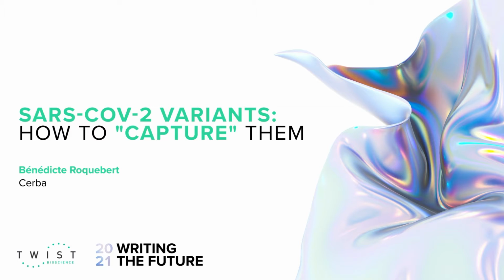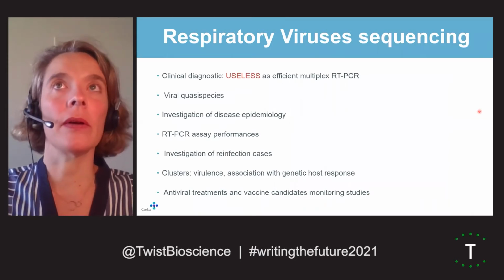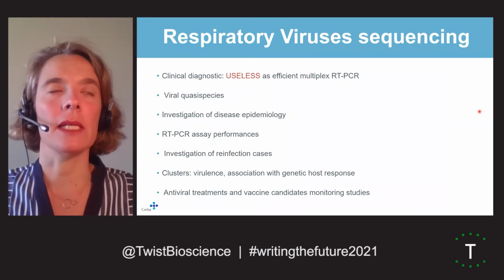To get started, I work at Cerba laboratory, which is a specialized medical laboratory with a platform and a unit of next generation sequencing for genetic and infectious disease. As soon as May 2020, we worked on a SARS-CoV-2 sequencing solution, or more exactly, on a respiratory viruses sequencing assay.